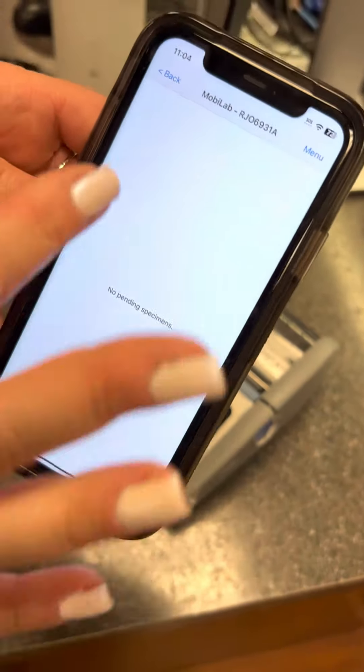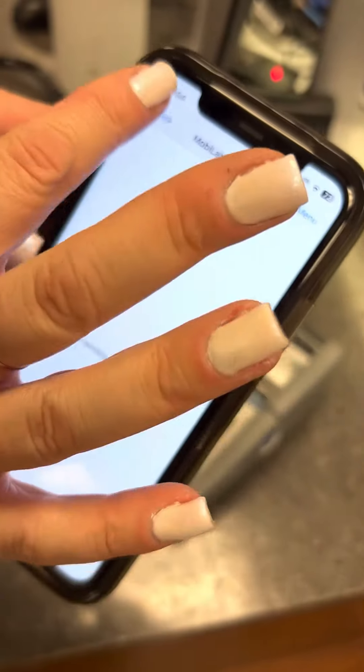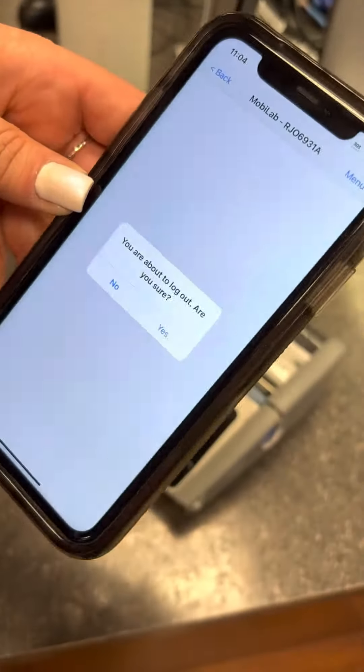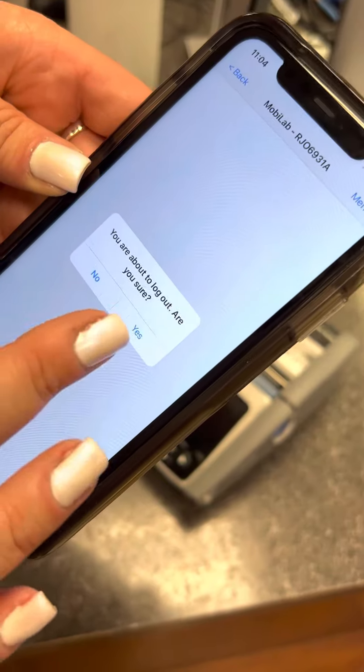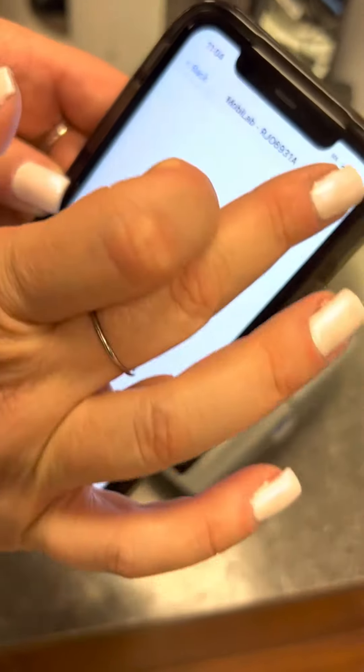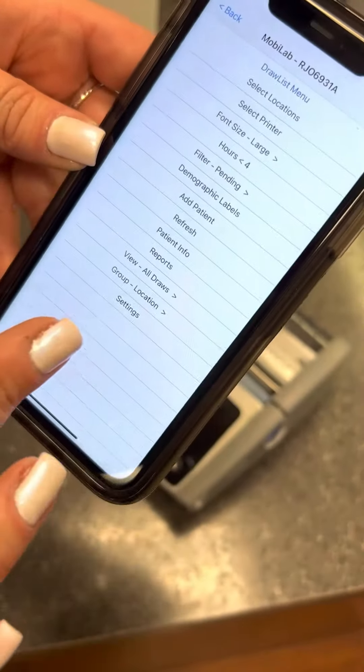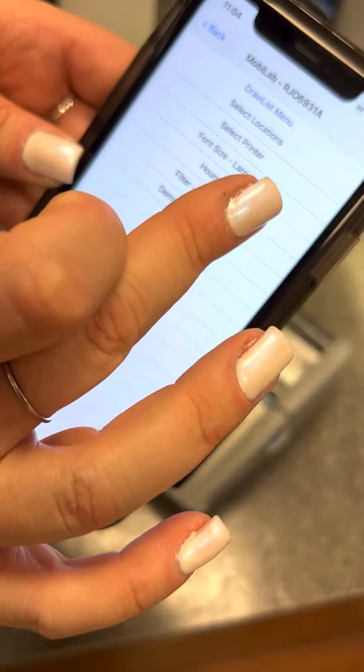So it says no pending specimens, but if I go back to the menu, you can select from there.